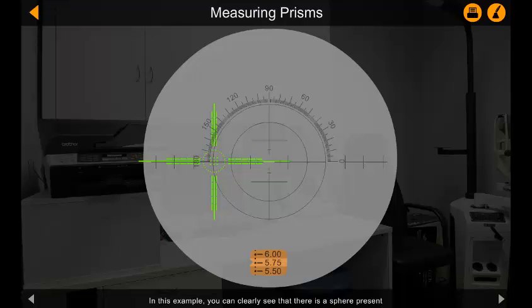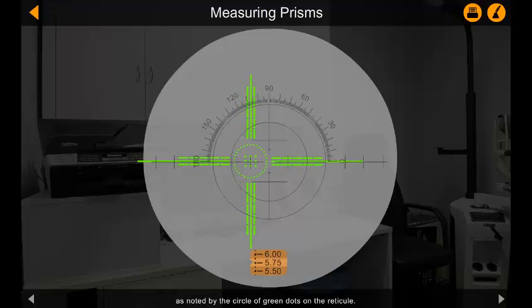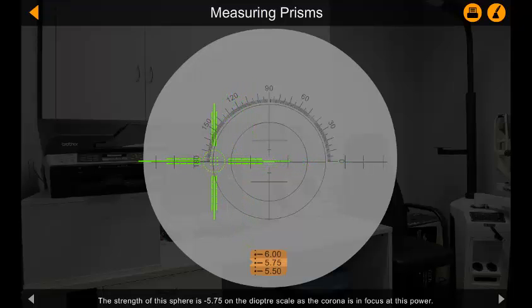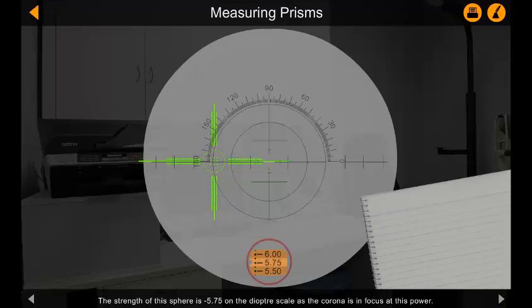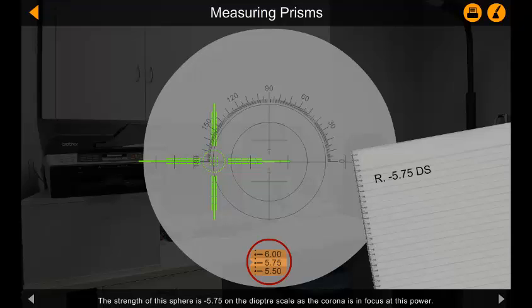In this example, you can clearly see that there is a sphere present as noted by the circle of green dots on the reticule. The strength of this sphere is minus 5.75 on the diopter scale, as the corona is in focus at this power.